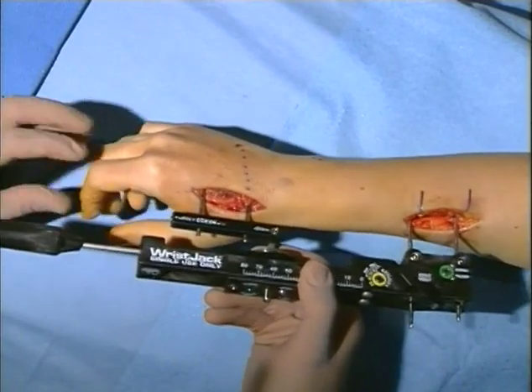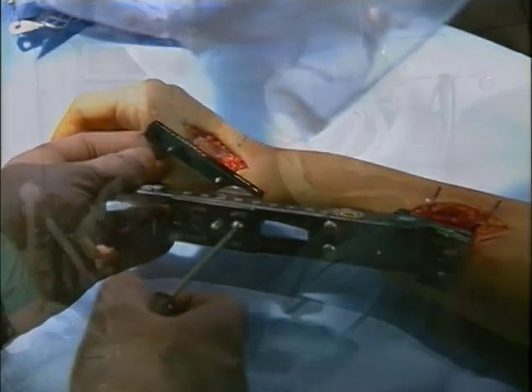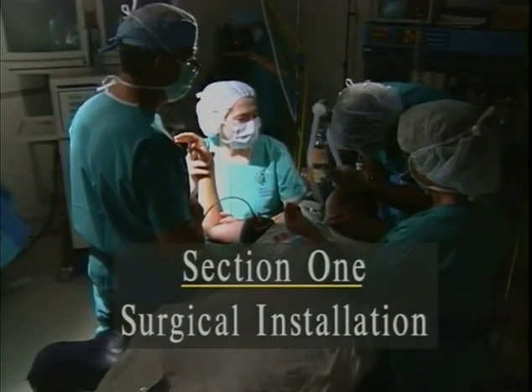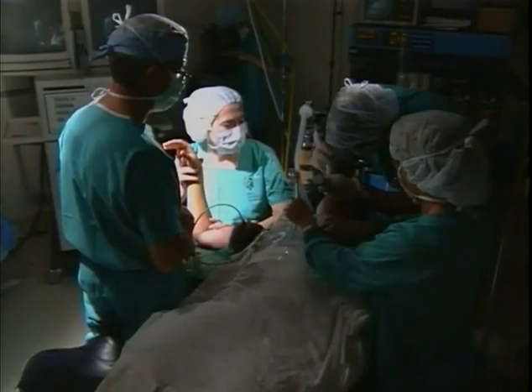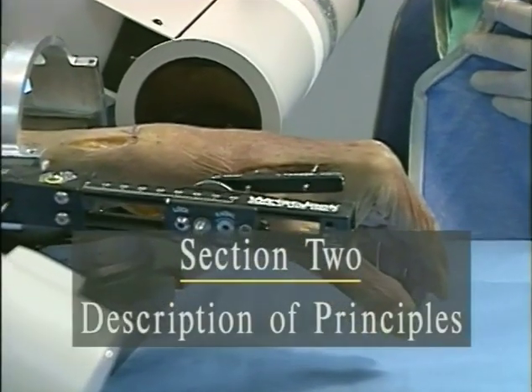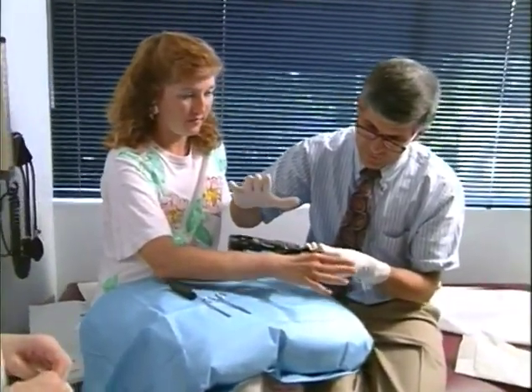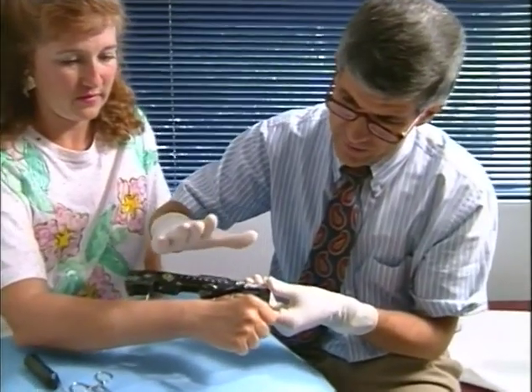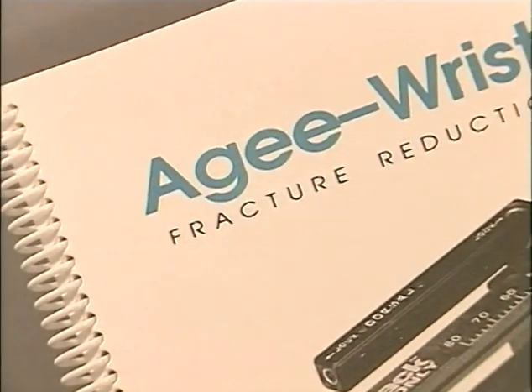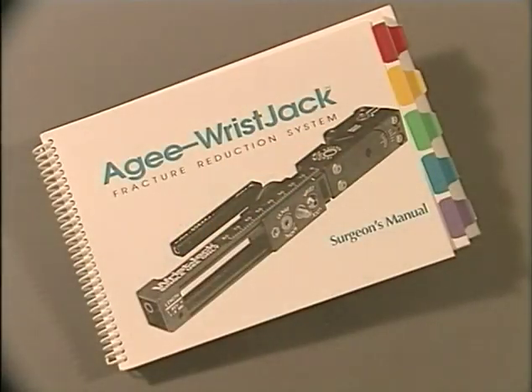The gear driven adjustments take advantage of the functionally intact soft tissue hinges to achieve ligamentotaxis in multiple planes. The first section of this surgeon's tutorial will explain and demonstrate the essential elements of the surgical installation of the Agee WristJack on an acute Colles fracture. The second section will utilize laboratory cadaver experiments to provide a description of principles appropriate to fine-tuning fracture reduction, helping the surgeon selectively obtain fracture reduction while avoiding hand stiffness, carpal tunnel syndrome, and other hand complications.